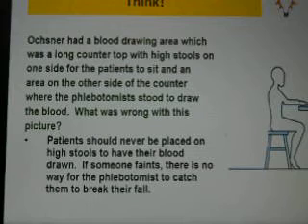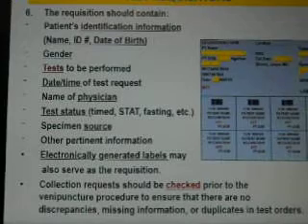So, the patient should never be placed on high stools to have their blood drawn. If someone faints, there's no way for the phlebotomist to catch them to break their fall. Somebody could really be hurt. This is a bad idea, okay?